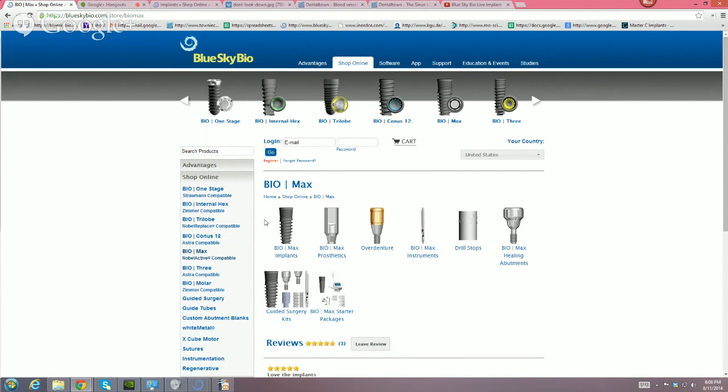And nowadays, I don't see much of a reason to put in 6s and 7s. We sell a lot of 6s and 7s, but those are used in immediate molar sites. But that's my opinion. You know, a lot of people have opinions. Who says mine is correct? Any other questions? I think that pretty much wraps it up.